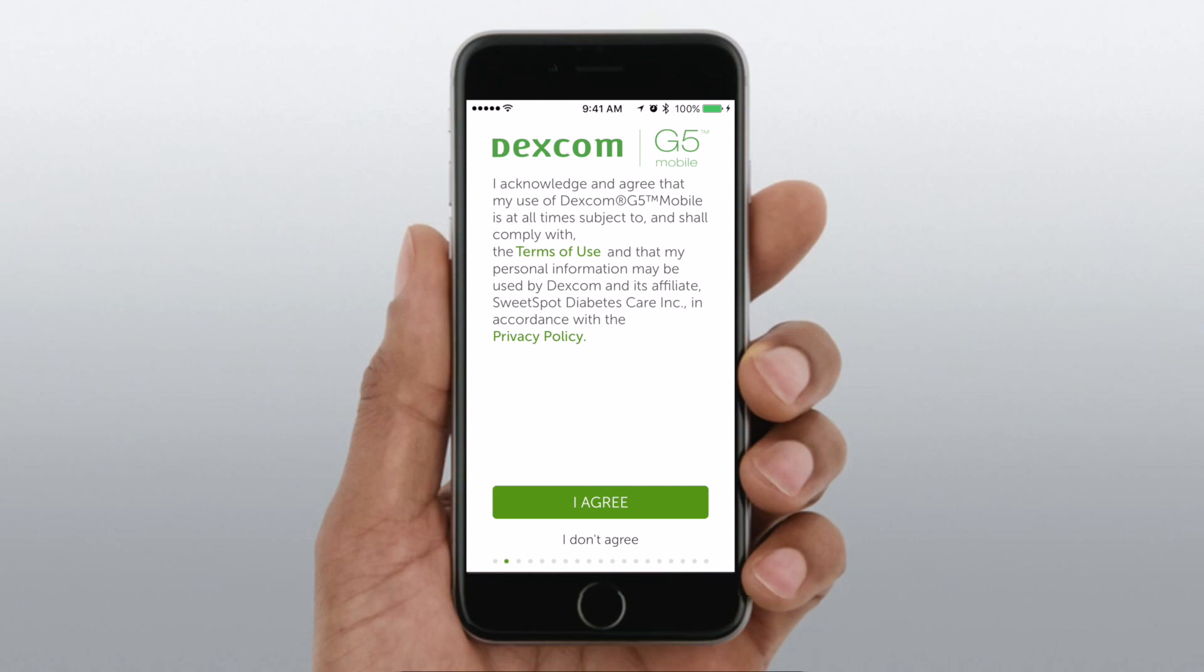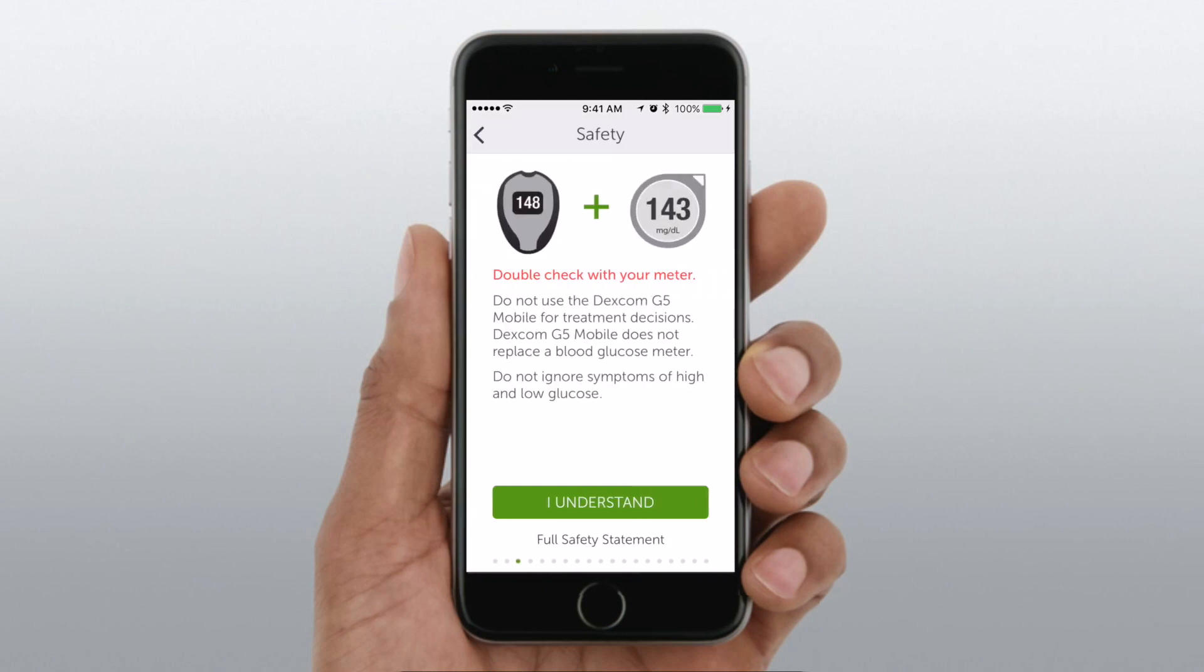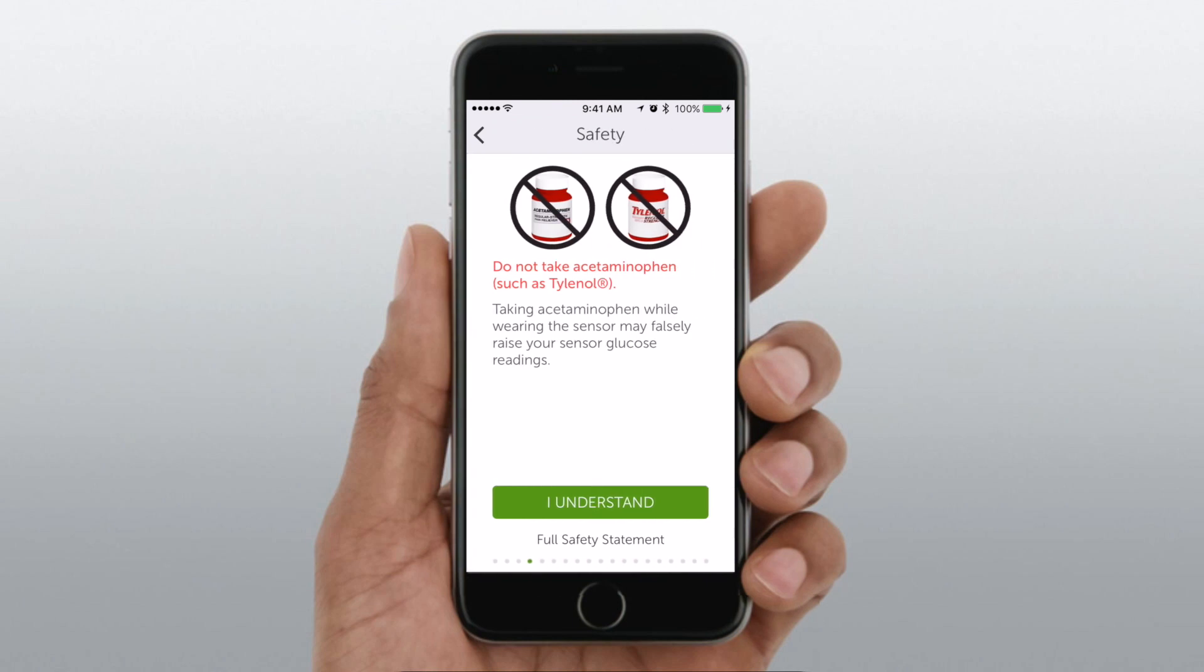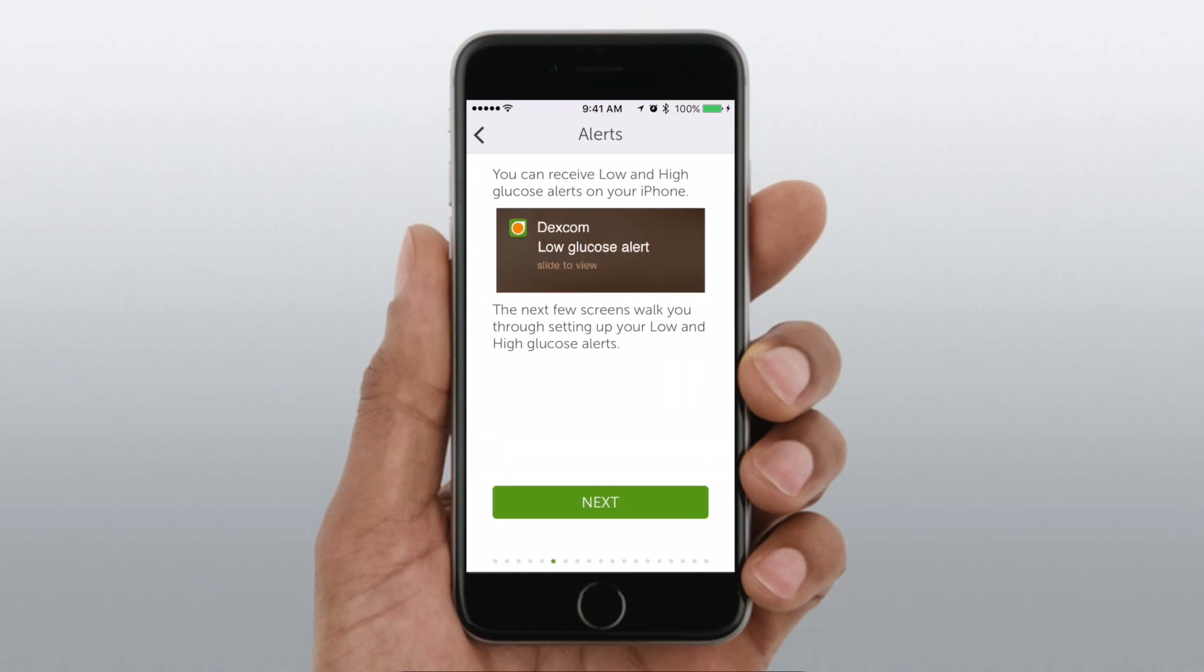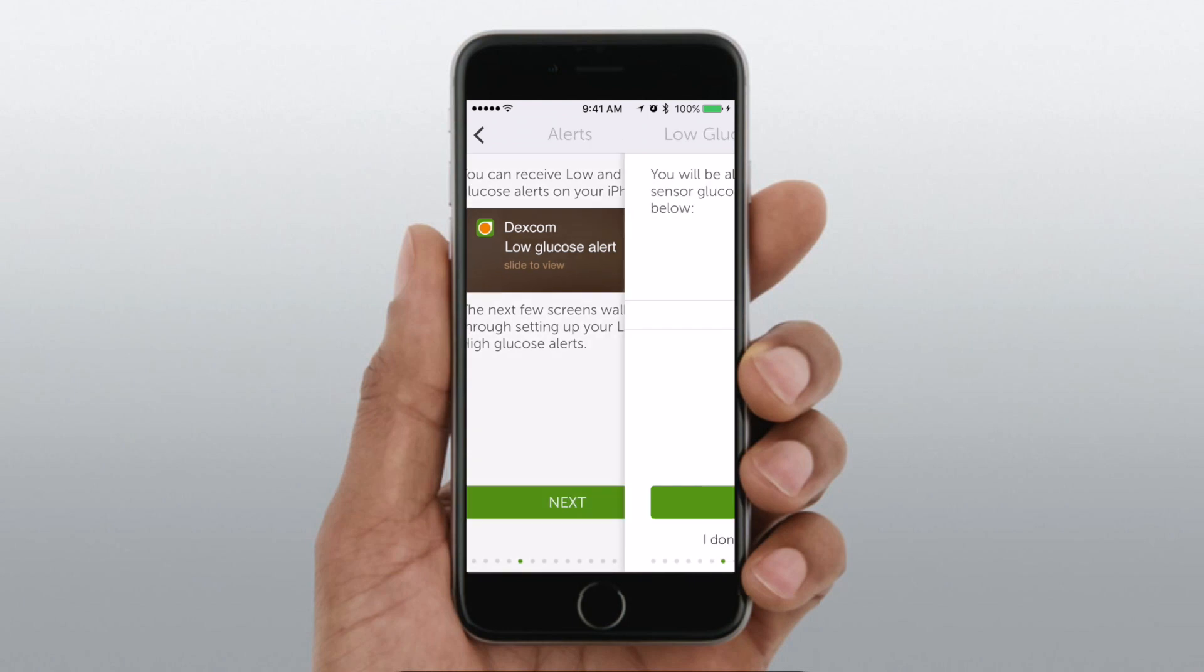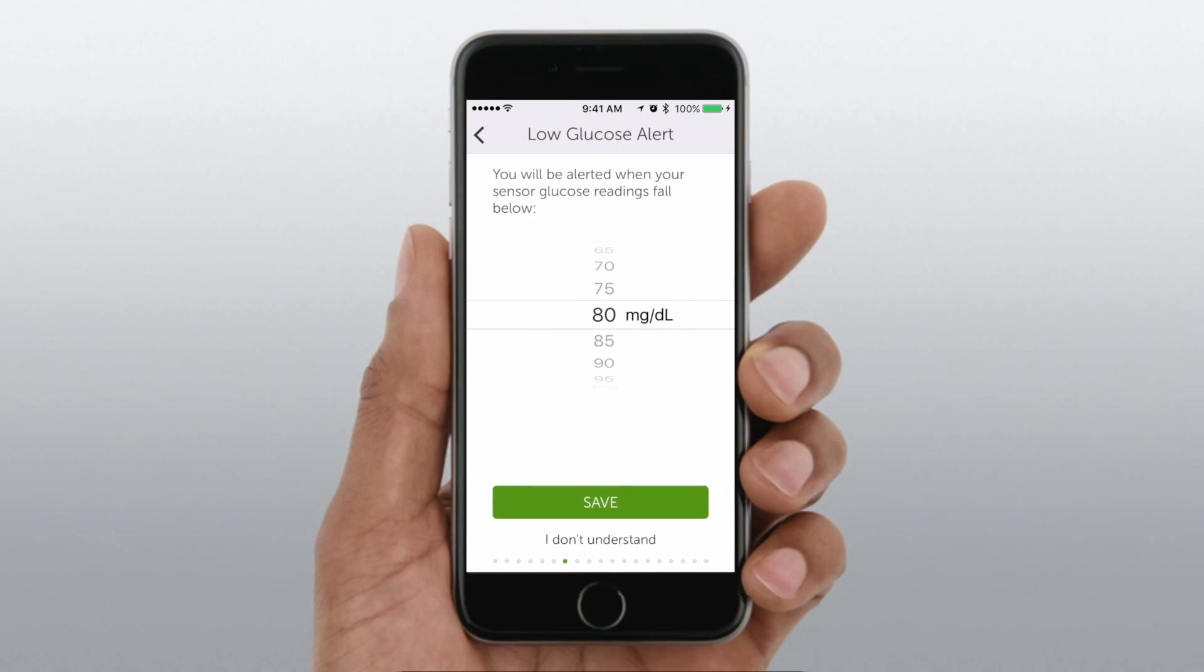Now when we're setting up this application, it has you walk through this little getting started guide. So first you accept the terms and services. You're going to be notified that you should always check with your meter before acting on any of those blood sugars. You should make sure you don't take anything like Tylenol that can artificially change your blood sugar. Stay away from MRIs. You know how to use alerts on your new phone instead of on the receiver.